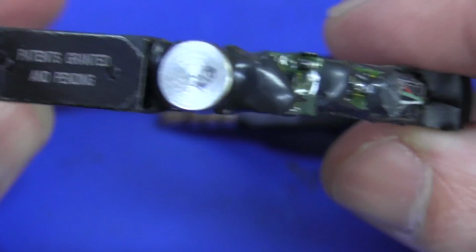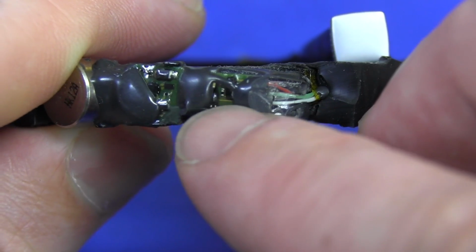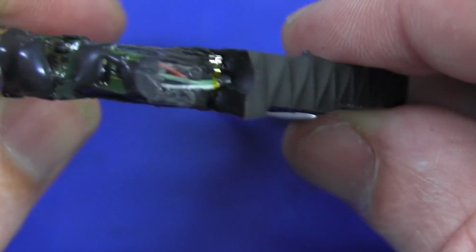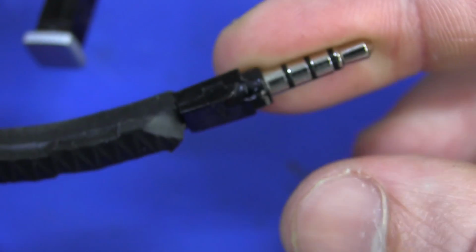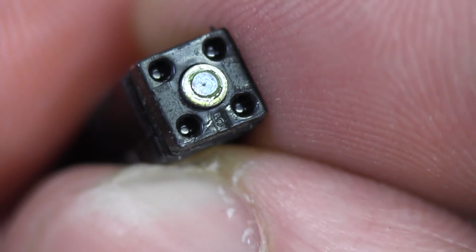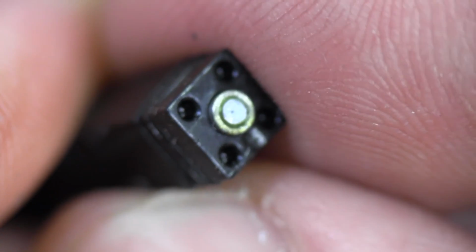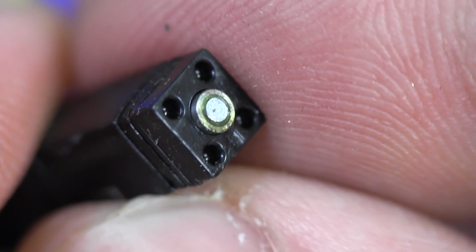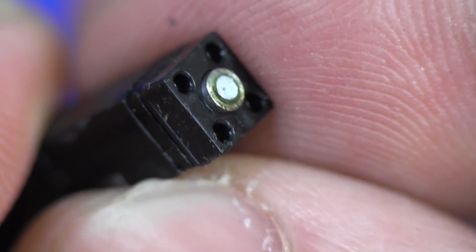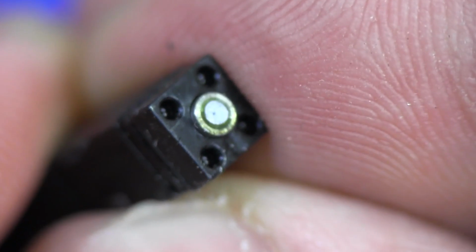Go figure. But I mean, here's the board, and then they actually have wires running off. From the board in here you can see a couple of tiny surface mount parts, and then they have a bunch of wires just running down into the TRS jack. I took the cap off the other end, and you can see that there's some sort of connector interface in there. Clearly some sort of test slash programming interface for production. This wouldn't be for the user, I'm sure.